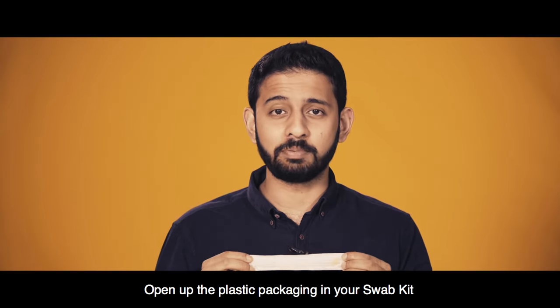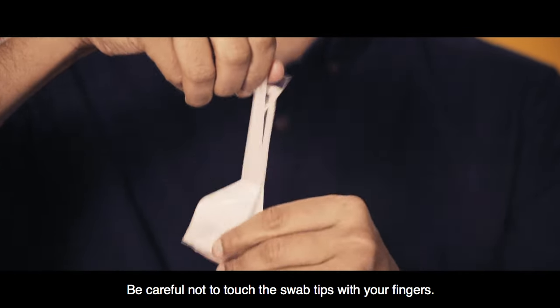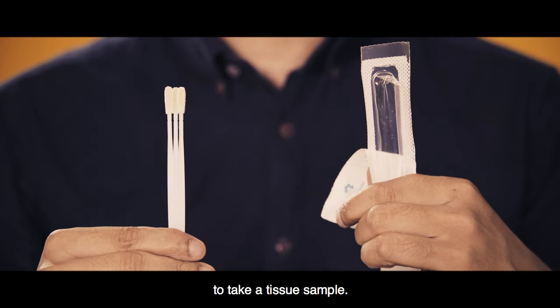Open up the plastic packaging in your swab kit and take out the swabs. Be careful not to touch the swab tips with your fingers. Remember to use each swab only once to take a tissue sample.